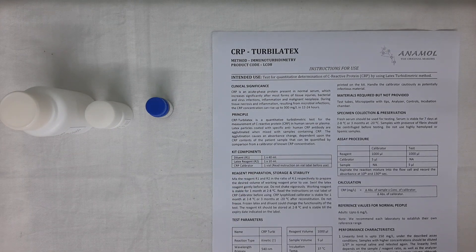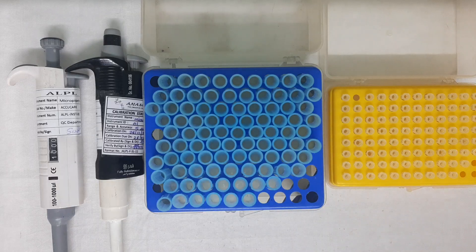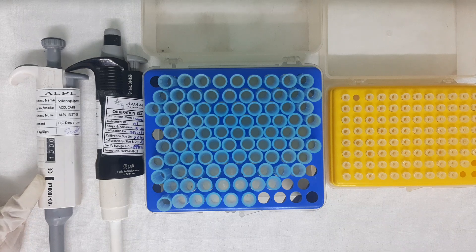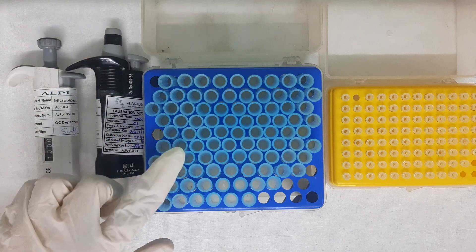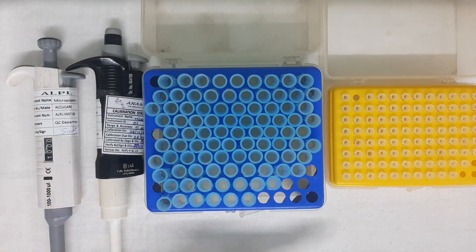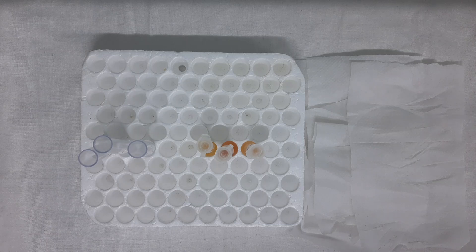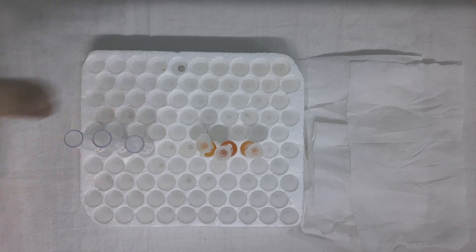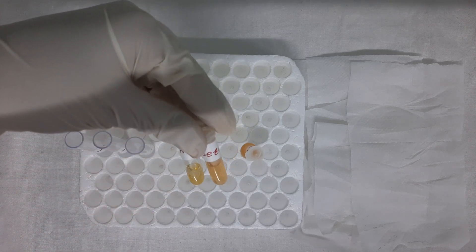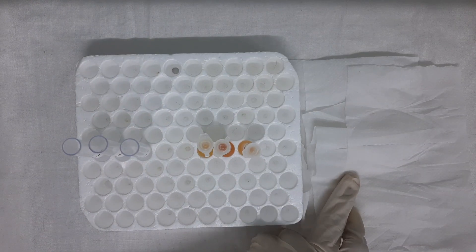We recommend all users to read the instructions for use thoroughly before using the test. Apart from this, you may require additional items such as a clean and well-calibrated pipette of 100 to 1000 variable volume, a clean and well-calibrated pipette of 5 microlitre fixed volume, clean and dry tips of 1000 microlitre and 5 microlitre volume, clean and dry tubes labelled for blank, calibrator, and test, a patient serum sample, and clean and dry tissue paper.